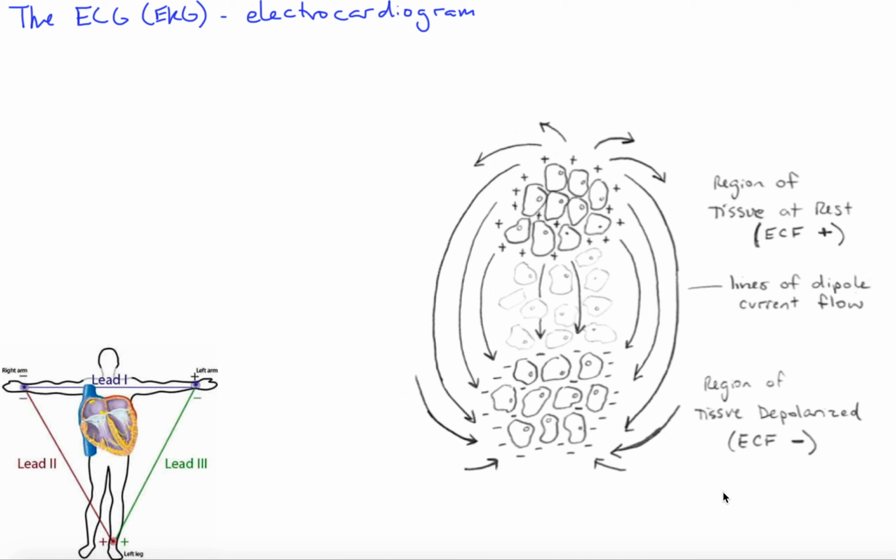So what I want to do now is give you the basis of this ECG recording. To do so, we have to understand a couple of key things. The first one is something we've already seen: what an intracellular recording is. If we have a cell, it could be any cell, we talked about it before with neurons in AMP1, and we wanted to measure the membrane potential of this cell.